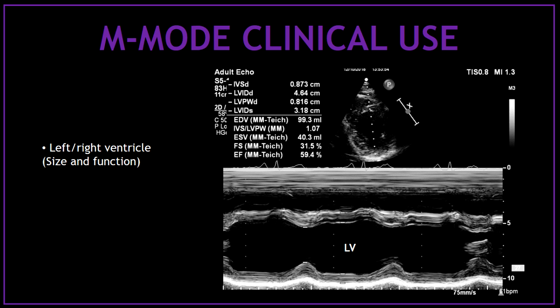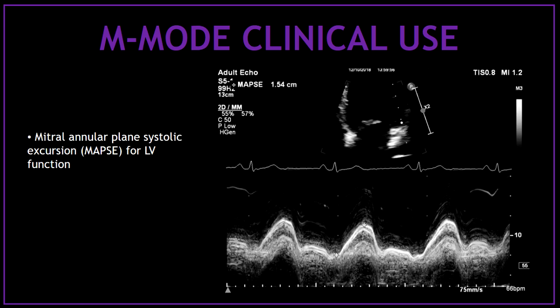Also, in every scan we use the M-mode to measure the longitudinal systolic function of the left ventricle. You can measure the systolic excursion of the mitral annular plane, also known as MAPSE. This is an index for left ventricular function. You can measure the MAPSE on the lateral annulus as well as on the septal annulus.